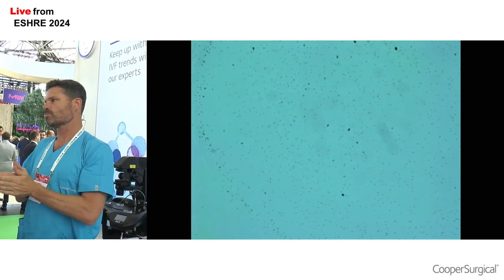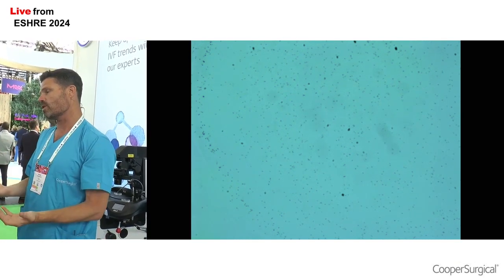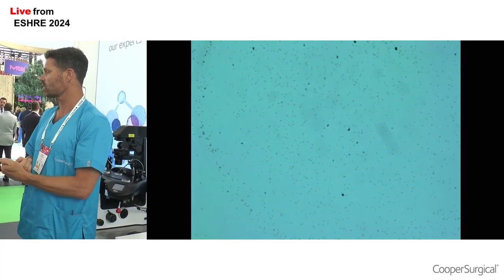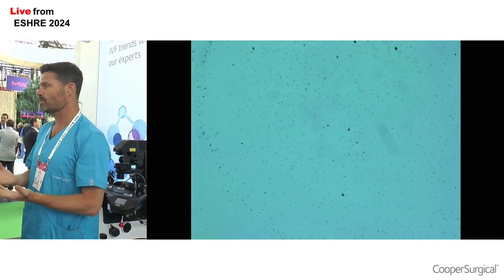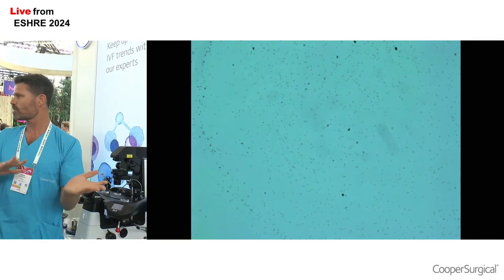We want to select sperm which we can see are motile because they're moving their tail. They have a good morphology, but we also have an extra selection criteria, which is that they're expressing the receptors for hyaluronic acid, so their head will be bound to the surface of the dish.